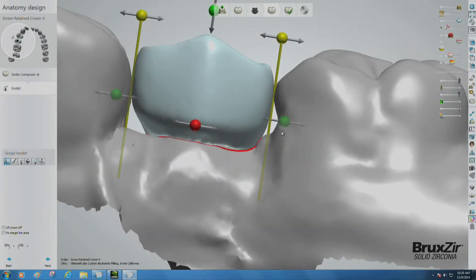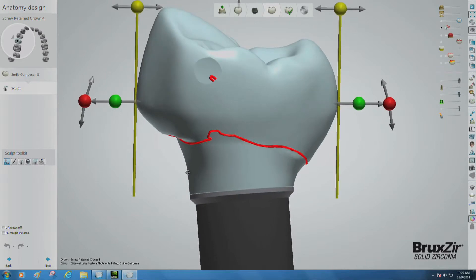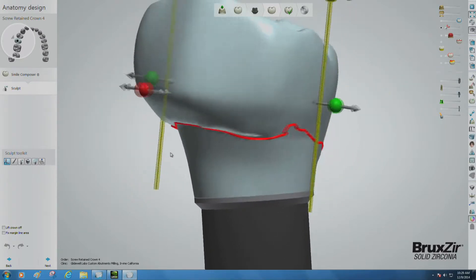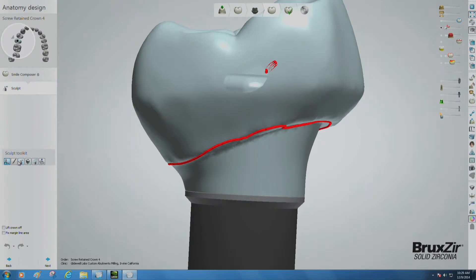Now we've arrived at the sculpt stage. Before adjusting any other part of the restoration, spend some time where the crown and emergence profile tool connect. To fix it, select the wax knife tool on the lower left side of the screen, and then choose the smooth setting.